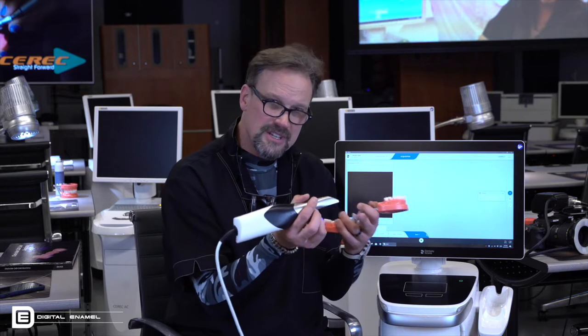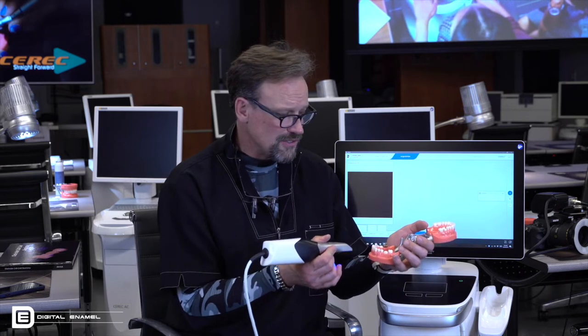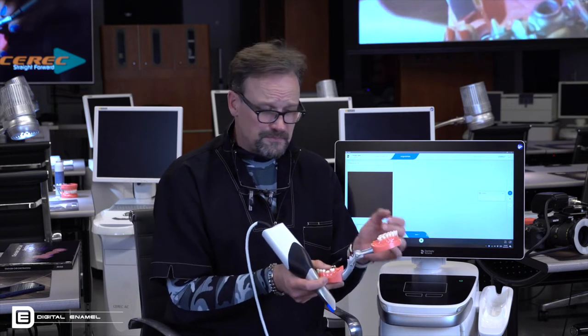And there's a lot of data. There's a lot that's going to fill up the entire rectangle. Or you can go right on the occlusal surface. I personally try to go right on the occlusal surface to start. Now on the upper teeth, the maxillary teeth, that's pretty easy because there's no tongue in the middle or anything, but you could start on the buccal and move posteriorly.